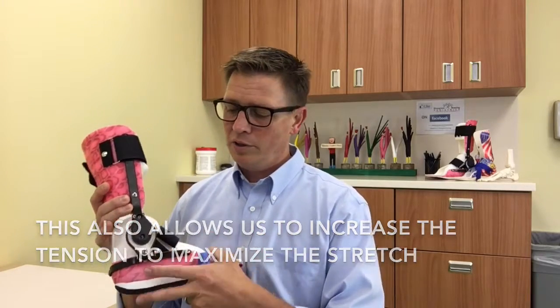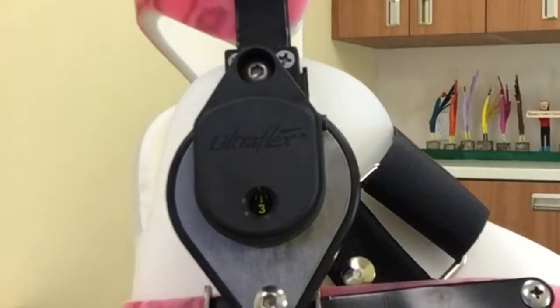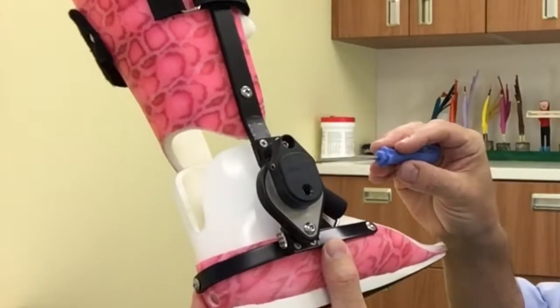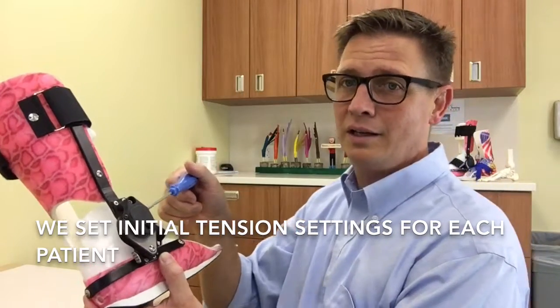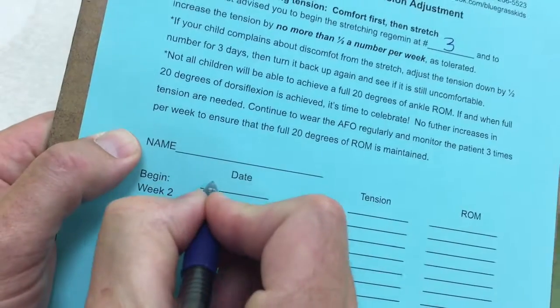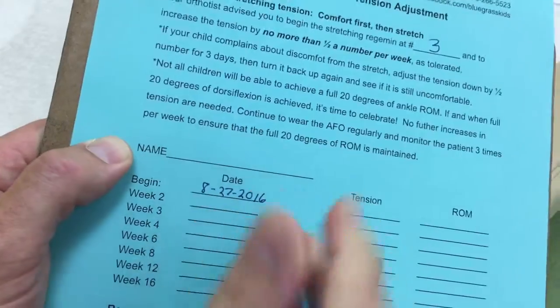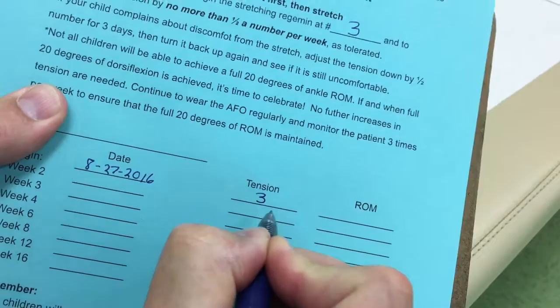It varies depending on the joint and the size of the patient, but with this particular joint there is a numeric scale, and we set up a program with the patient and send them and the parents home with a tool to increase or decrease the tension as needed and as tolerated. We set them up with a program whereby we start with a certain amount of tension, and we ask them to gradually increase that tension by one half number per week as long as the pressure is still tolerable.